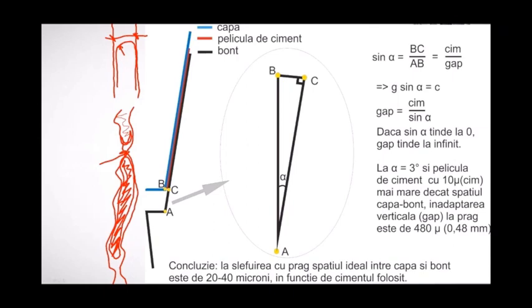It's like two bumpers, one in front of the other, and there's no space for the cement. What do you have there? A highway for the microbes. What do they do? They eat your tooth, your abutment. That's what they do.